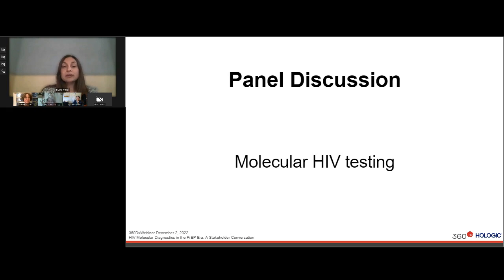When someone has had exposure with or without symptoms, and we really want a tighter window period, meaning within 7 days, can we detect that somebody has HIV, because that window period is longer with antigen and antibody testing, at least 2 weeks. And so typically in standard of care, when people are coming for PEP and PrEP, we're looking at exposure, acute HIV, getting this test when needed.